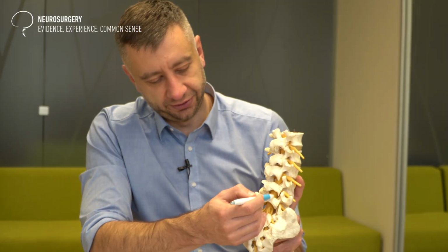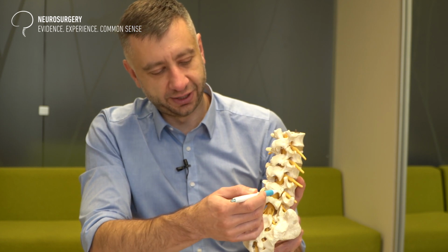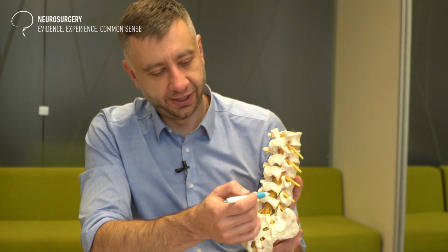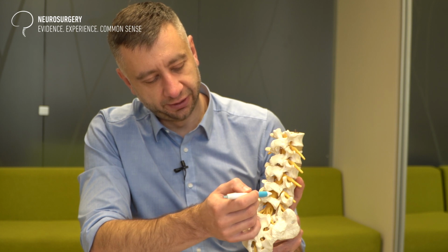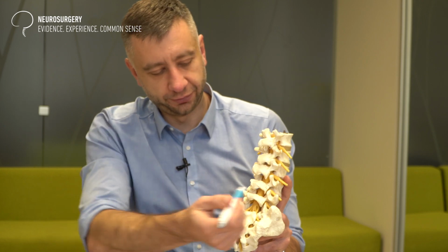Then this interspace is covered by the ligament, which is called ligamentum flavum, or just flavum. It's a yellowish color. We take this ligament out, and usually we are almost immediately able to see the nerve root, which is usually pressed upwards towards ourselves.